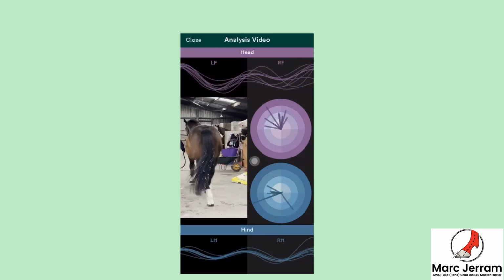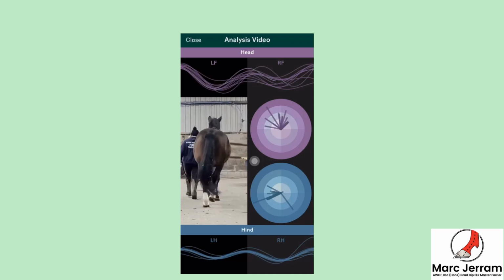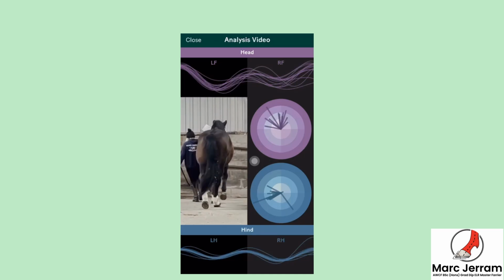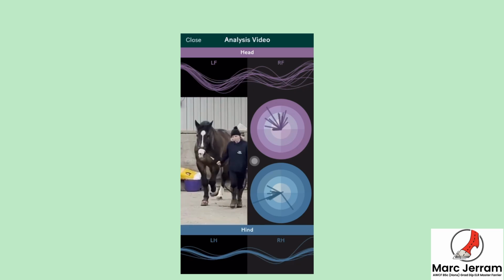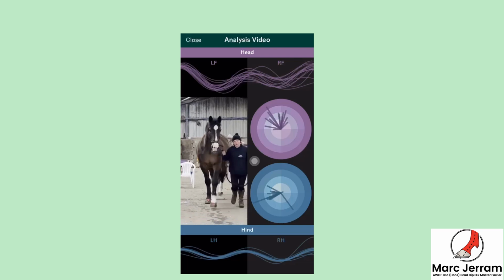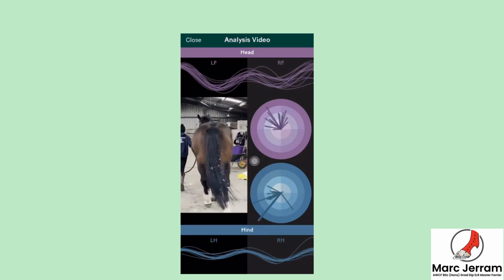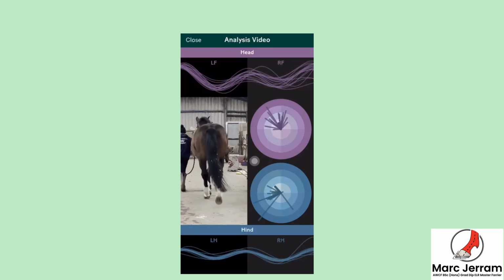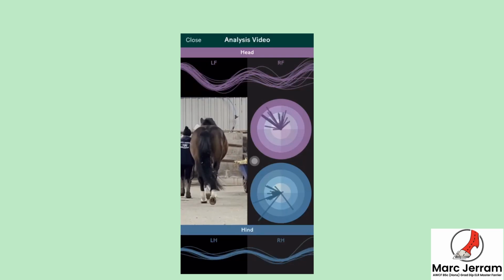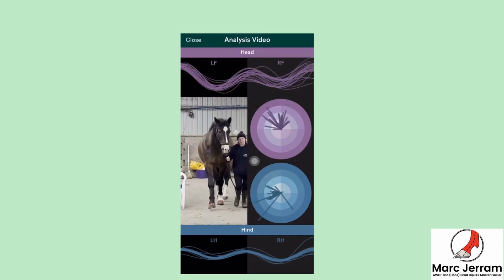So a nice flat level surface or indoor, we can clearly see. It doesn't need to be well lit, but that always makes for a good assessment anyway. You can see horses move nice and clearly. What we've got to call the bullseyes on the right hand side, the dartboards, show each individual strike, each individual stride, and how it corresponds to the level of asymmetry present. The vertical displacement graph underneath as well shows you how much variation there is between the strides, and if it's nice and fluid and tight like behind, you've got less issues than what you have in front.